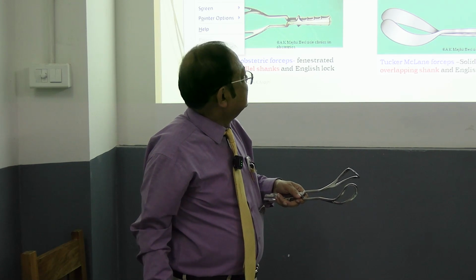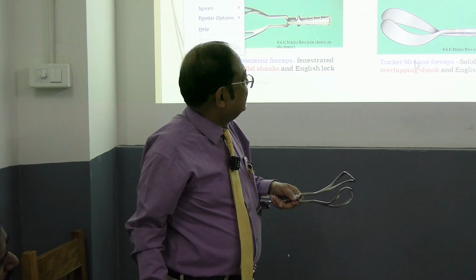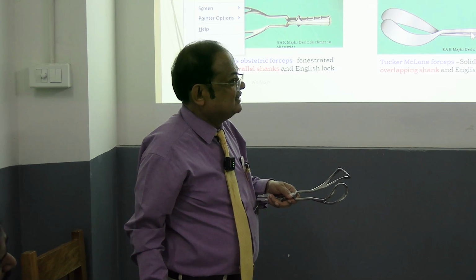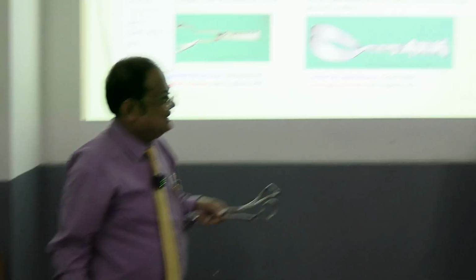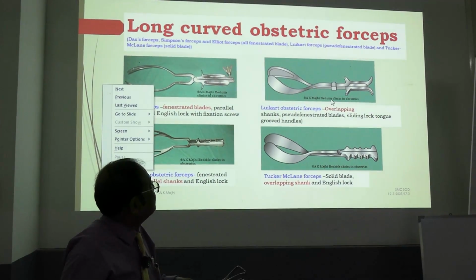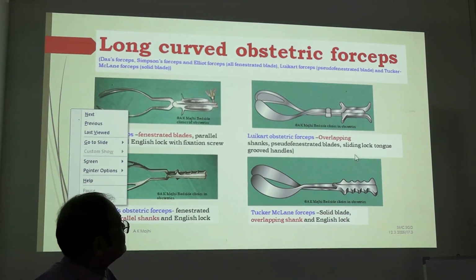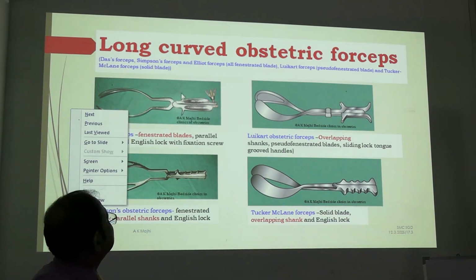You will know everything. And the lock, you see, the lock here is the overlapping sign. This is the overlapping sign. And also this is the English lock, but this is the side lock, the sliding lock. Here is the sliding lock, and this is only the English lock.